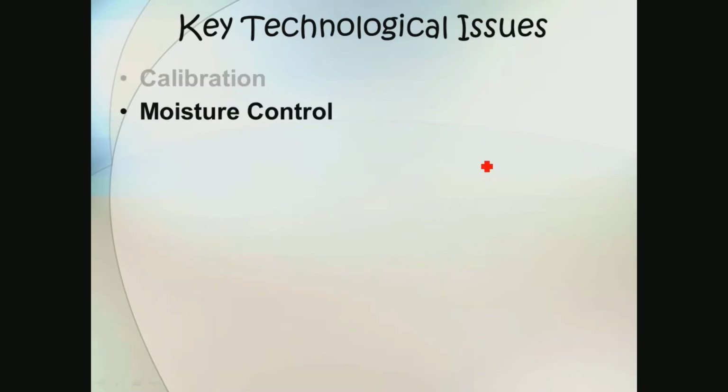Very important to control for moisture. Any collection of humidity on the photodetector impairs the ability to analyze correctly. This is definitely true in the mainstream, because the humidified gas is passing right in front of the sensor. But it's also true of sidestream analyzers, because as that humidity is pulled back, the ambient temperature drops from what's in the airway, and you have condensation being created.